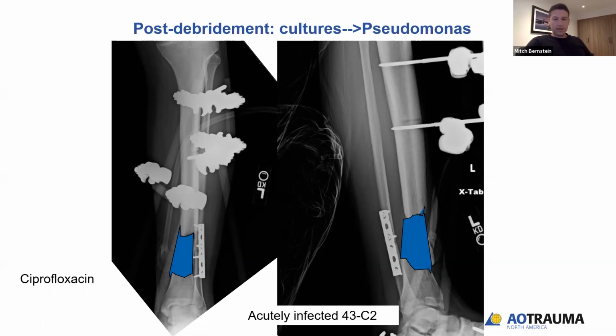Well, I would make a problem list and see what the issues are. So I would see how much bone loss he has, maybe 6-7 centimeters there. Yep. It's infected with Pseudomonas. He's IT, so he likes cool gadgets. So I would talk to him about an X-Fix to wear for 12 months. He'll probably like that. And I would get a plastic surgeon, and I would probably treat this with a circular fixator and a transport. All X-Fix transport, no internal fixation.